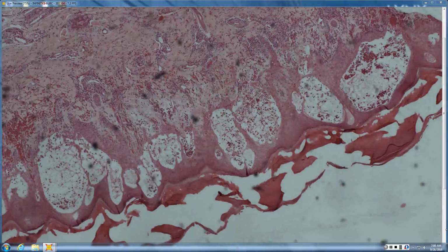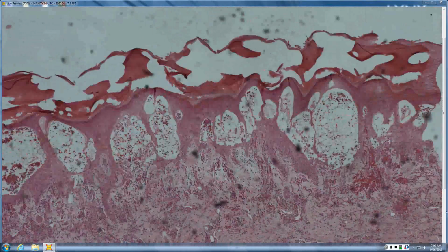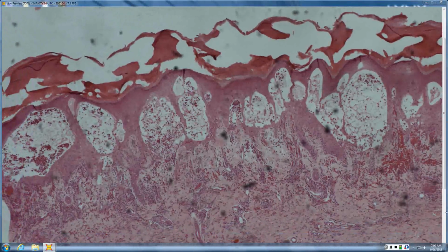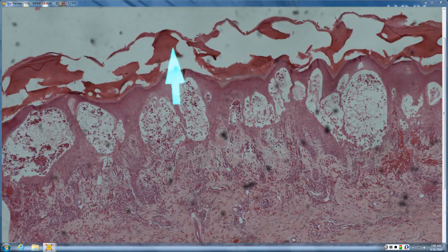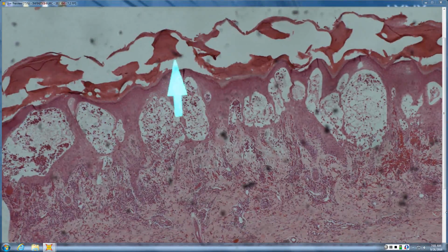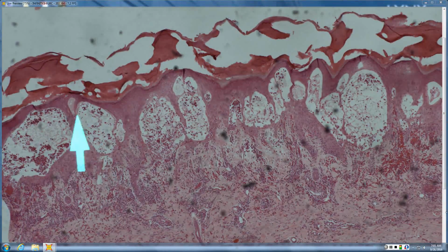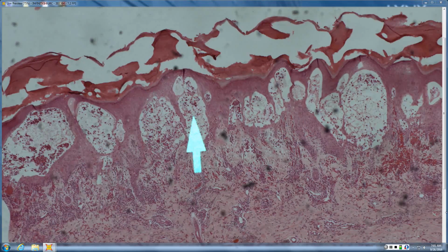Okay, flip this around. So this one is just acute spongiosis, and this brings up a differential as well. Now this slide has been damaged a little bit. It's not looking too great currently. The stratum corneum is all sort of broken apart. That's just from the way this tissue is processed, so that's not a normal feature per se. And obviously the big thing here are these huge intraepidermal vesicles. You can imagine as these get bigger, that's what you're seeing clinically, these big, huge spongiotic vesicles. And from scan, that's kind of the obvious thing.